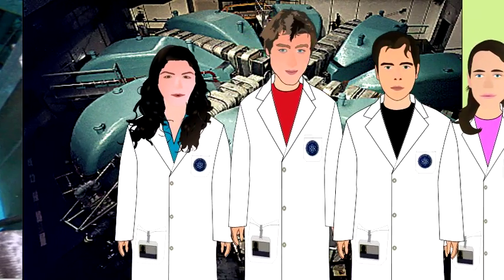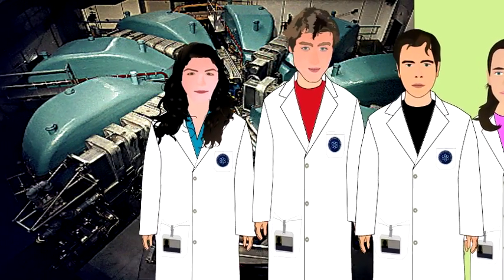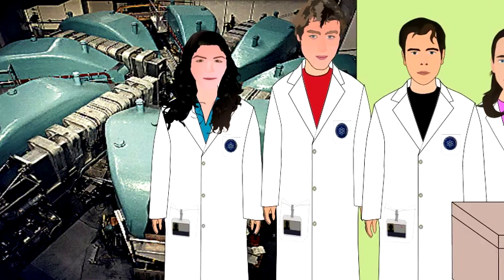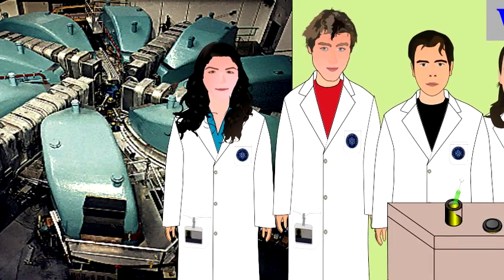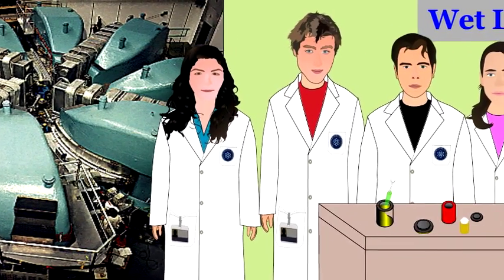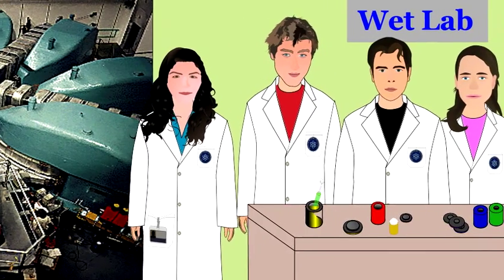Nuclide generator. Nuclide generators are systems for holding parent isotopes, which have long half-lives and can be transported and stored without losing activity. They decay into daughter isotopes with low half-lives. They can be easily separated for clinical use.